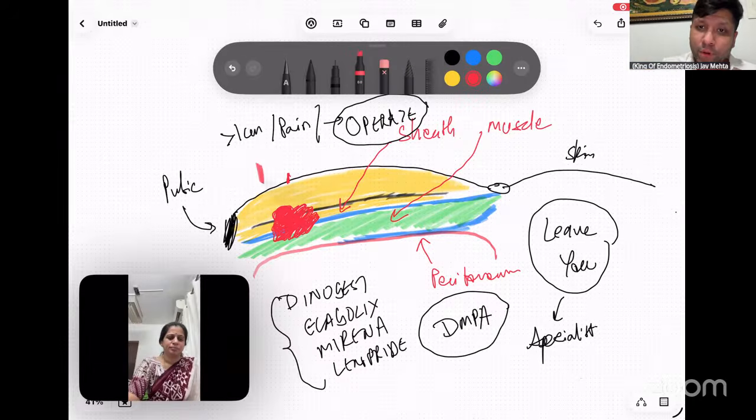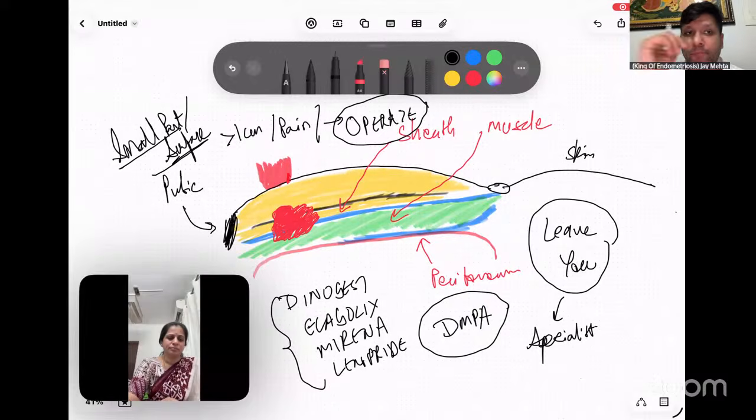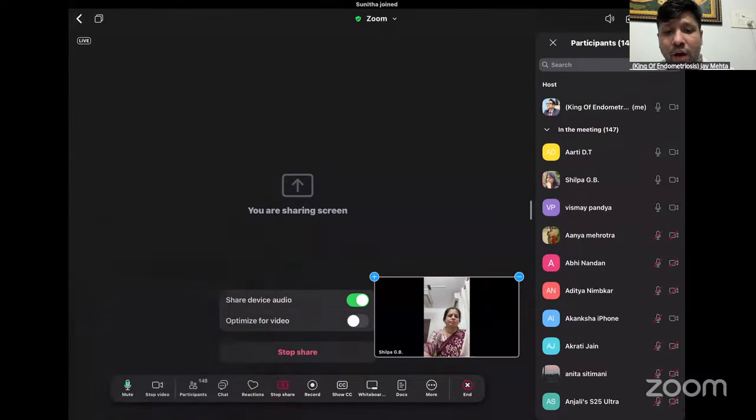You take a beautiful probe, and this sonography probe is going to be kept on the abdominal wall. The best way to do this ultrasound is by using something called a surface probe, or small part probe. It is a simple probe setting which is available in almost all the probes across the ultrasound machines of the country. And you must take this configuration to diagnose superficial abdominal wall endometriosis. This finishes the understanding of anatomy.